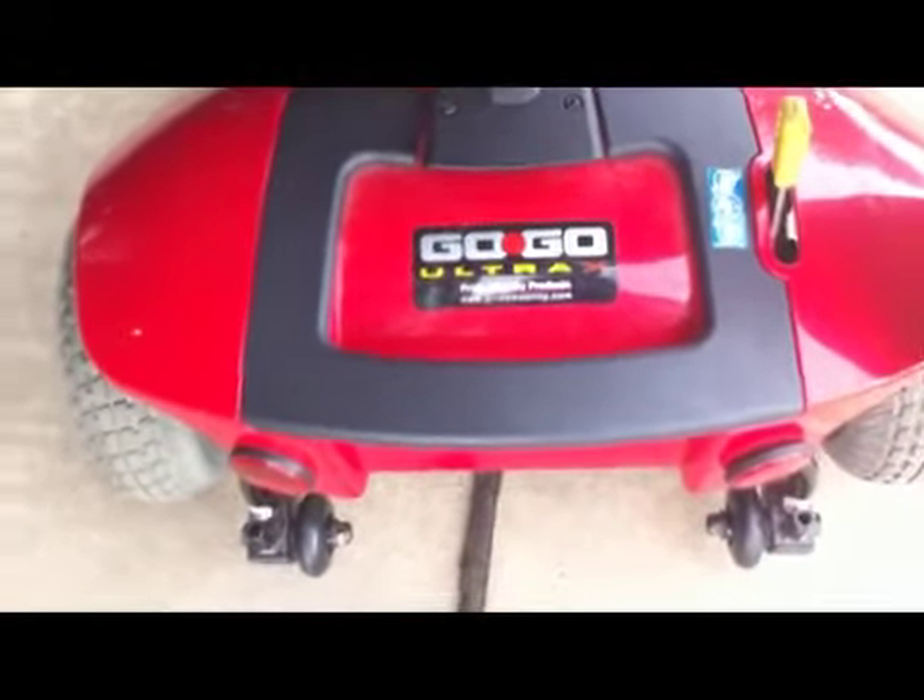Here's my scooter. I'll show you the tag — it's the GoGo Ultra Pride Mobility products. I believe we got it at the scooter store, and I've had it for three years. We got it on sale — it was $1,000, but we got it for $700 if I remember correctly.